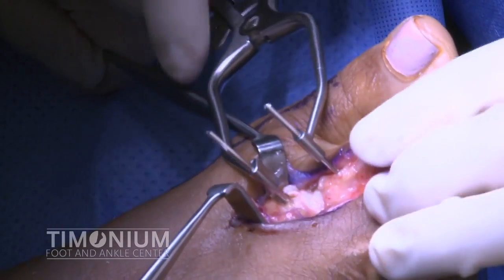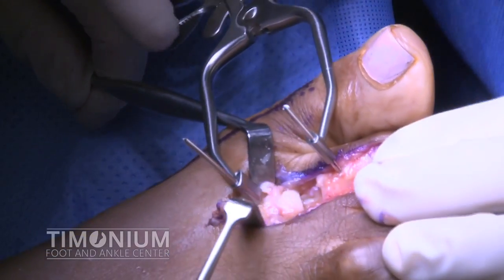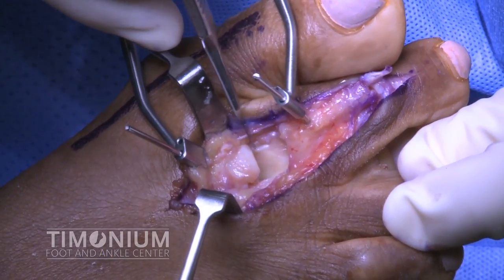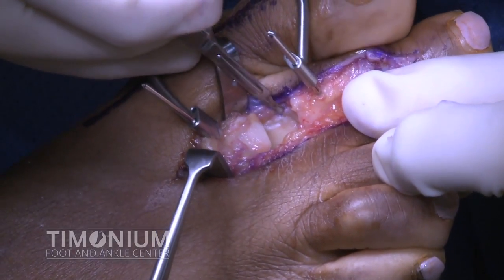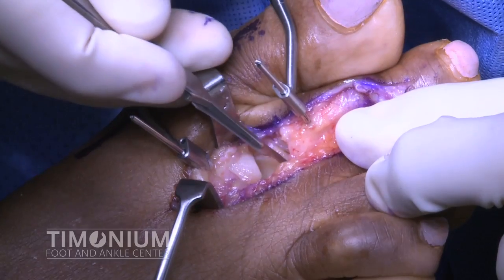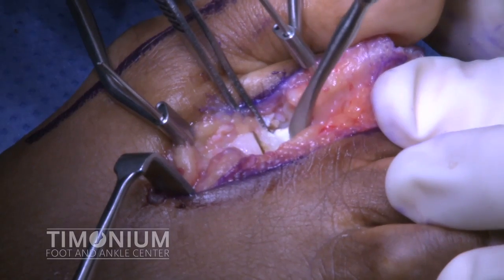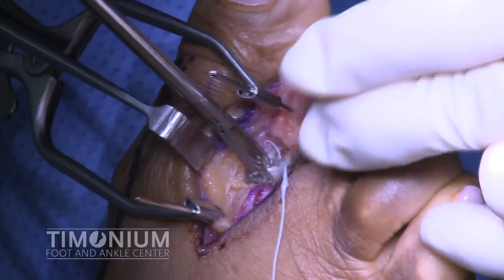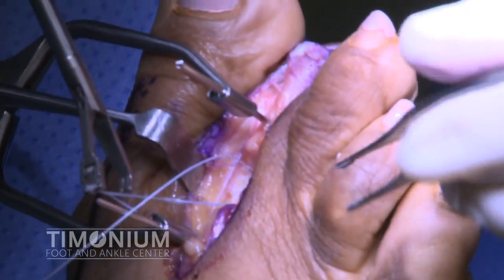A second wire is then placed into the base of the second digit proximal phalanx. A joint distractor is then used to open up the second metatarsophalangeal joint to expose the plantar plate. The plantar plate is carefully transected and removed off the base of the second toe, with care taken to avoid cutting the underlying flexor tendon. The plantar plate is within the pickup and the intact flexor tendon is identified beneath the freer elevator. Next, the Arthrex Scorpion system is used to introduce the fiber wire into the plantar plate, creating a horizontal mattress suture in the plate.